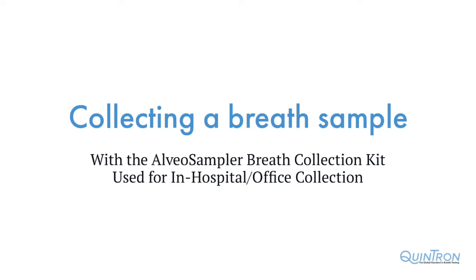In this brief tutorial, we will demonstrate how to collect a breath sample using Quintron's Alveo Sampler Breath Collection Kit. This test kit is used for active breath collections in the hospital or office settings via a technician or nurse collecting the sample directly from the patient.